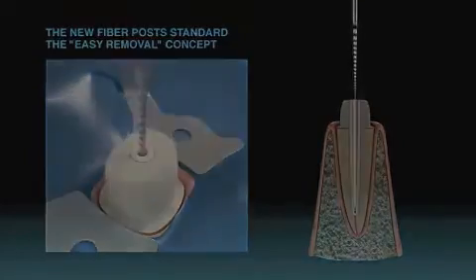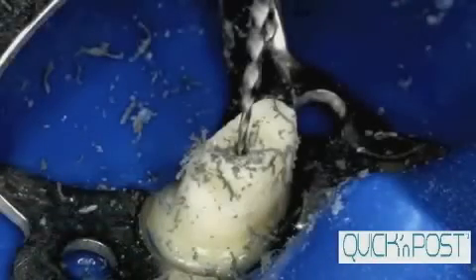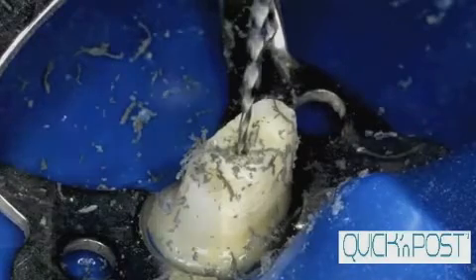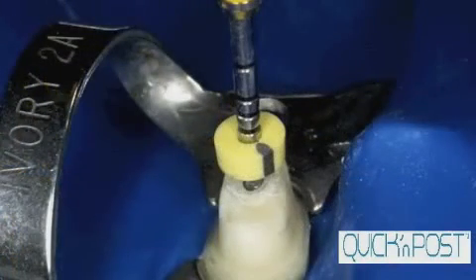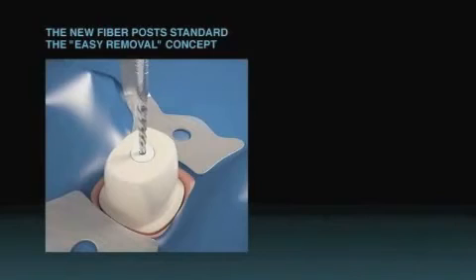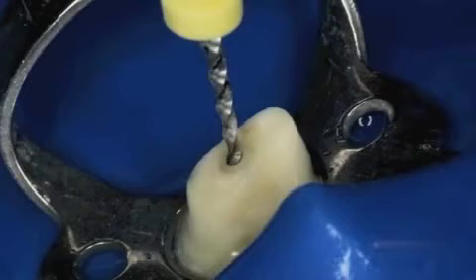Since the macrofibre is very soft, the instrument is guided towards the apical part by the hard walls of the post, without ever deviating from the central axis as occurs with normal posts. During the removal, the operator can clearly see that the instrument is penetrating the macrofibre, thereby assuring a sense of certainty that is rarely felt during the removal of a conventional post.